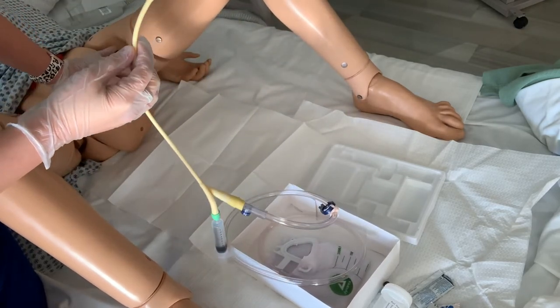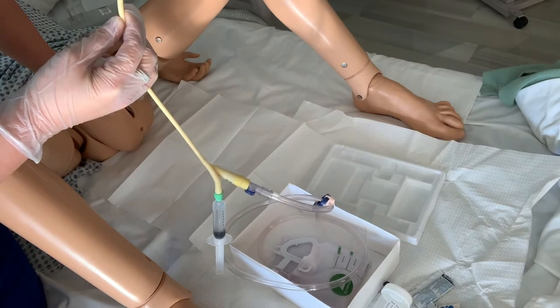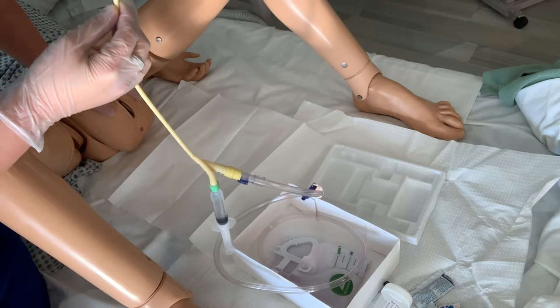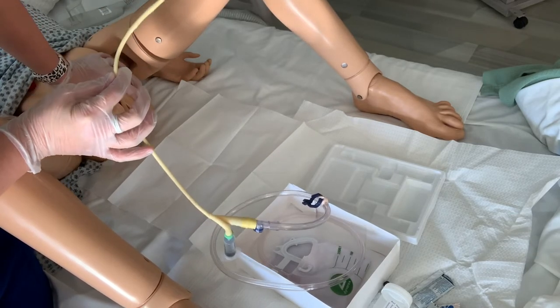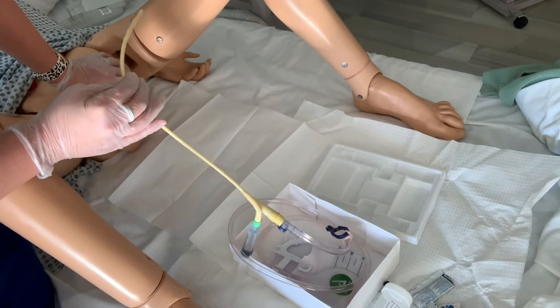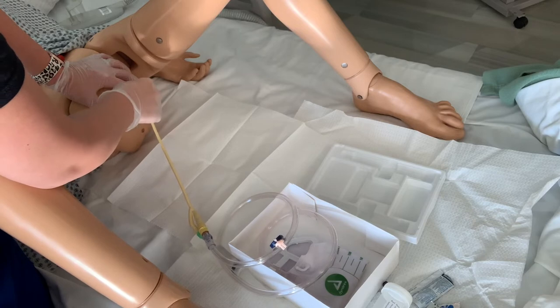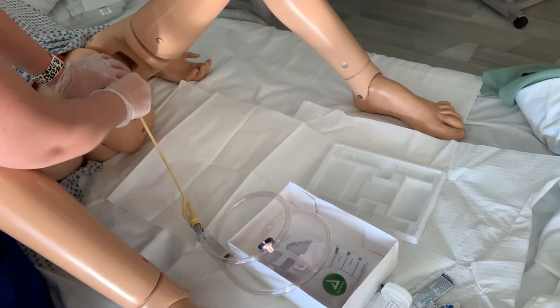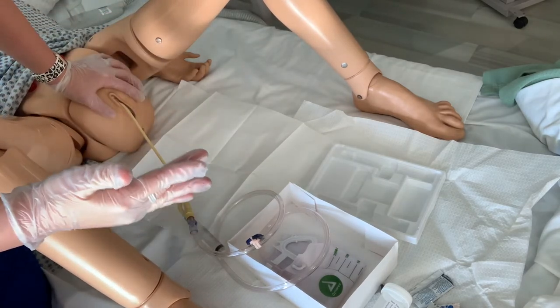Now we're going to insert our Foley catheter. Leaving our non-dominant hand in position, we grab our catheter and insert it into the urethra until urine appears, then advance another two to three inches. If no urine appears, the catheter may have been misplaced in the vagina during a female Foley catheter — it is harder than it looks sometimes. If this happens, leave the catheter in the vagina as a landmark, and then insert another Foley catheter into the urethra to make sure you're not putting two in the same spot. Using your lubricated catheter, go in pushing steadily, making sure not to contact the labia with your sterile glove, pushing until we see urine, and then another two to three inches.